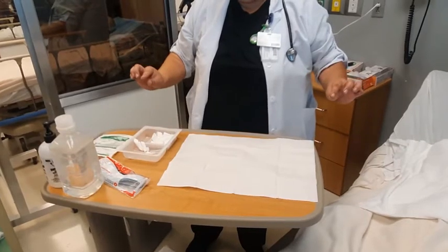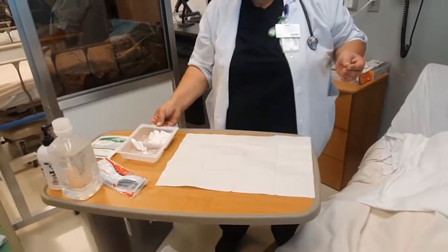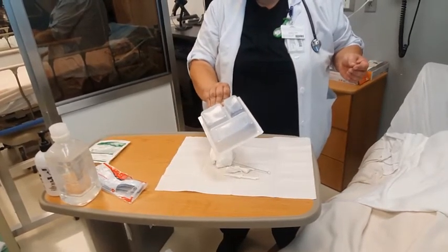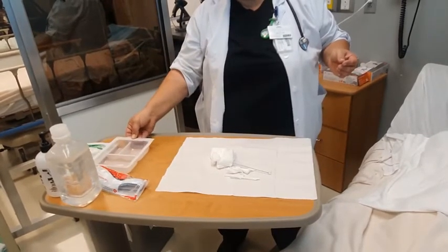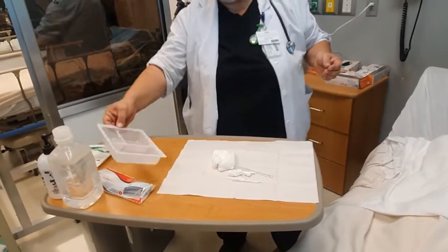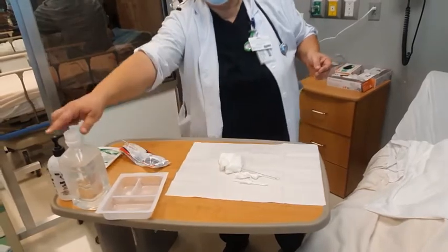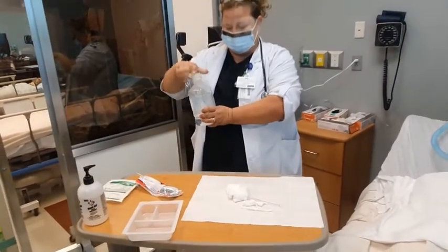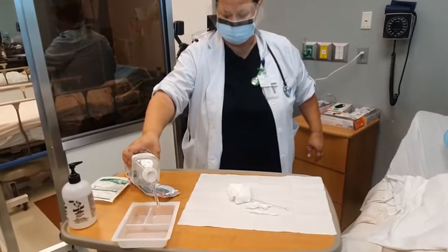Now you will dump your supplies. You then take the supplies right here underneath the drape in the center, and then you dump your supplies onto the table. Set this over to your far right or left, whichever is easier for you. And pour your saline into your sterile basin. Okay. You'll take the saline, not to cross over your field, and you'll pour some saline into the basin.